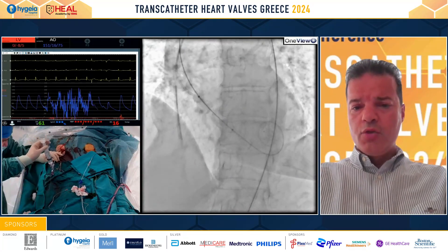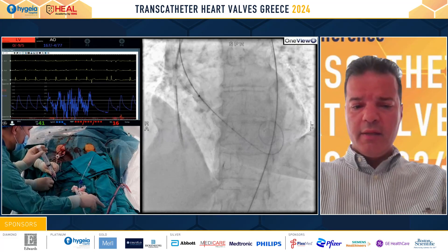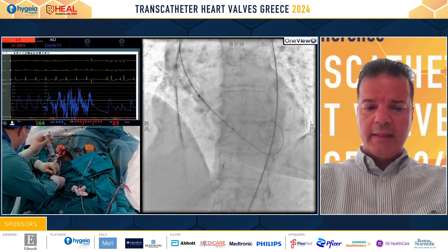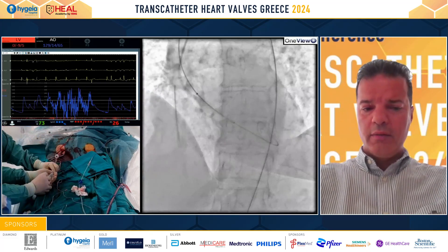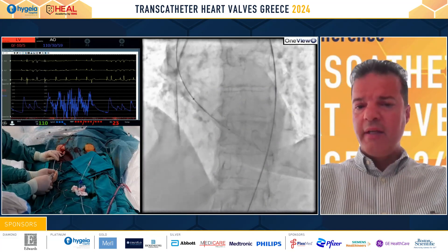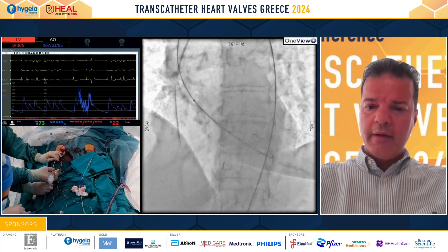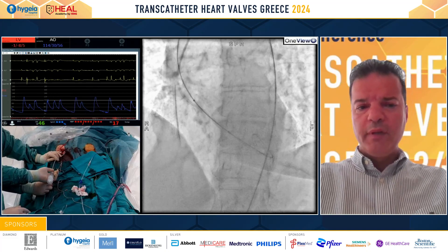You can see the balloon going in. The black clip goes on the Safari wire and the red clip is on the venous sheath wire in the RV. We pace at 180 beats per minute and inflate.